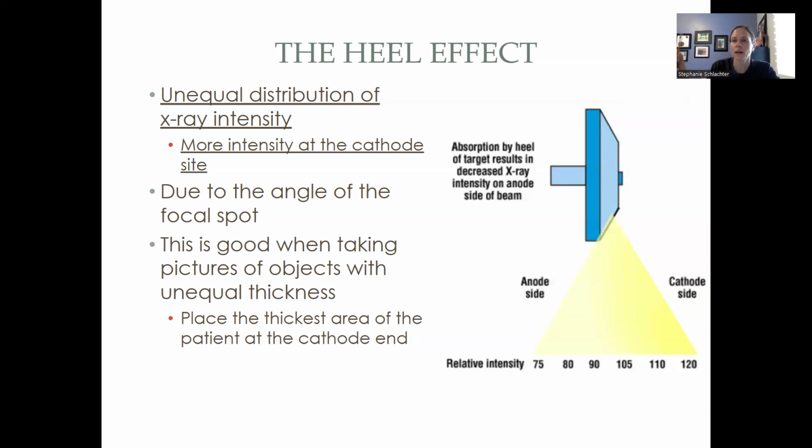And so if you look at it, right, here's kind of that angle. And then if these are my electrons coming across, if they hit up here versus down here, these electrons are stronger that hit up here versus the electrons that hit down here. What that then equates to, strong electrons hitting here is stronger X-rays coming down, okay? Weaker electrons hitting down here, weaker X-rays coming down.